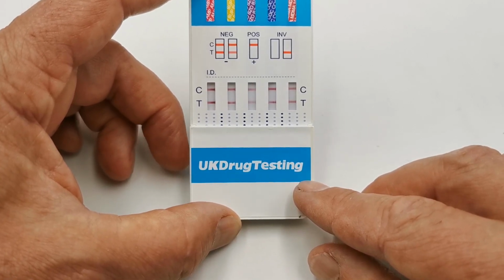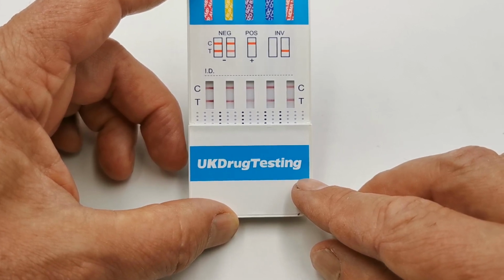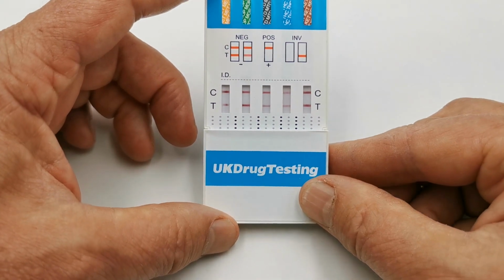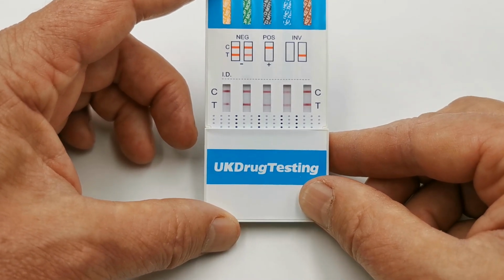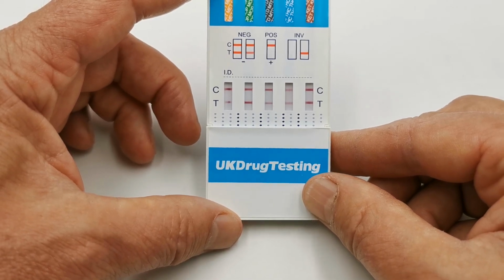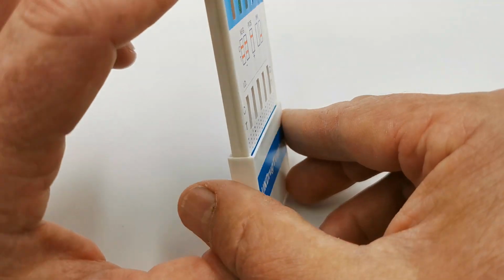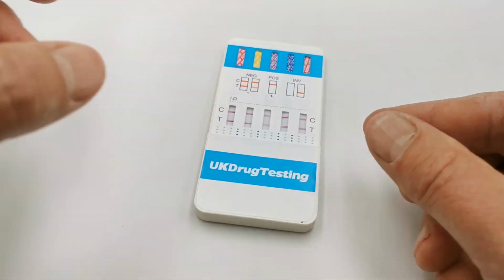If no test lines develop by 8 minutes, then that indicates a positive result where a control line is showing in the top half of that membrane's results. If that was the case, you would need to confirm what was causing that positive result on this screening test. Easy to do. If all the test lines are showing at 3 minutes, they're not going to change, and you can interpret the result as all negative and move on to the following test. But you must allow the full 8 minutes for a test line to develop before interpreting a positive result using this test.